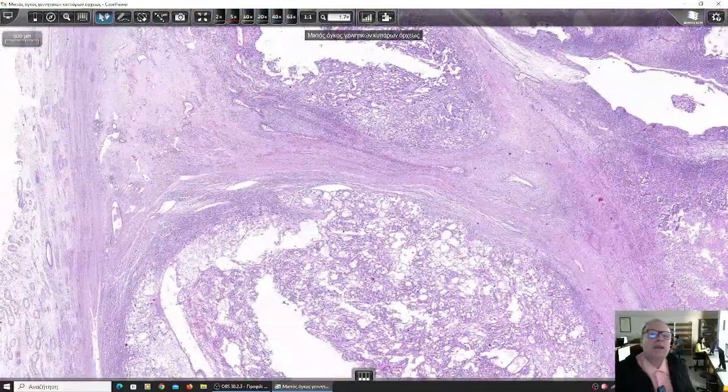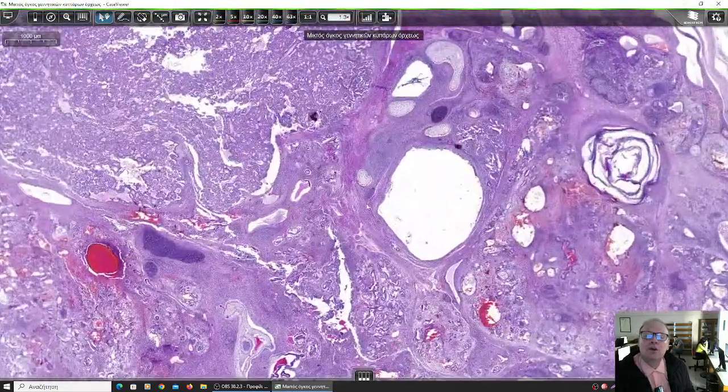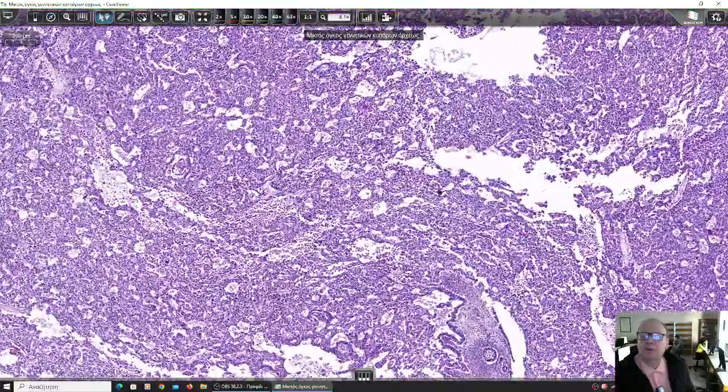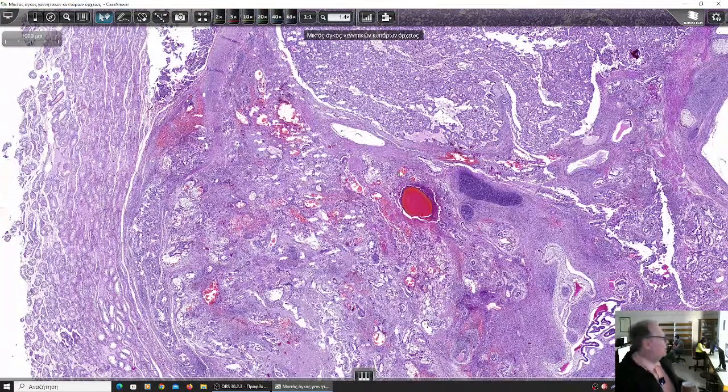Most common in these tumors, there is some sort of elevation at the levels of human chorionic gonadotropin hormone. So if such a patient has a pregnancy test, it might appear positive, because these cells are most often separate syncytiotrophoblastic cells which secrete human chorionic gonadotropin.